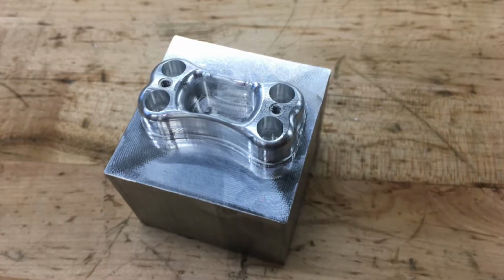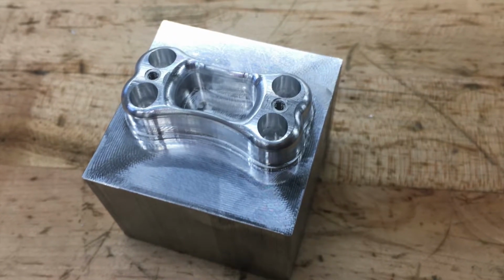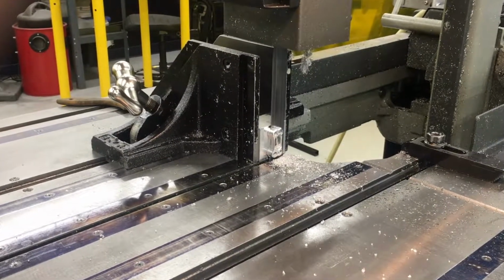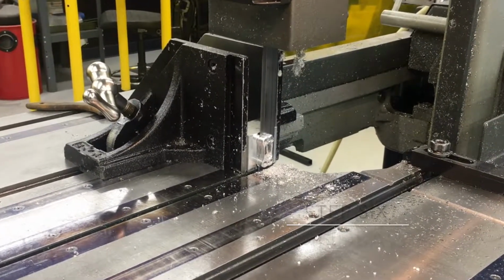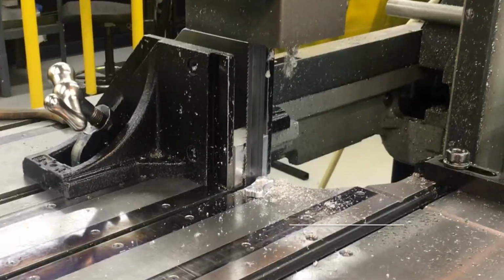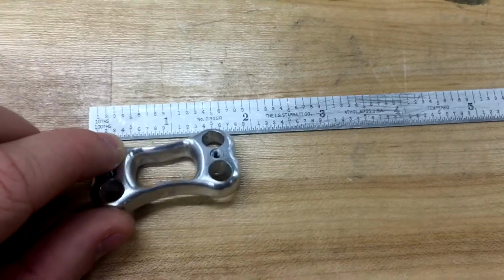Today, we will only be creating 3D contours on the front of the spinal implant for demonstration purposes. This means that the back of the part will be flat, having no curvature. For this reason, we can use the bandsaw to remove the implant from the workpiece. After sanding and polishing, our part is finished.